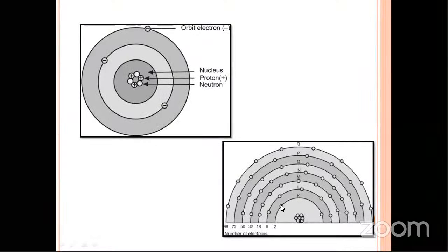Okay, so if we take tungsten as the most important element, which is used in the intraoral IOPA machines, the binding energy of tungsten with respect to the K shell is more than that of the L shell, and more than that of the M shell. That is why tungsten has a high atomic number, which can produce so many reactions, and hence tungsten is chosen as the element to produce X-rays.